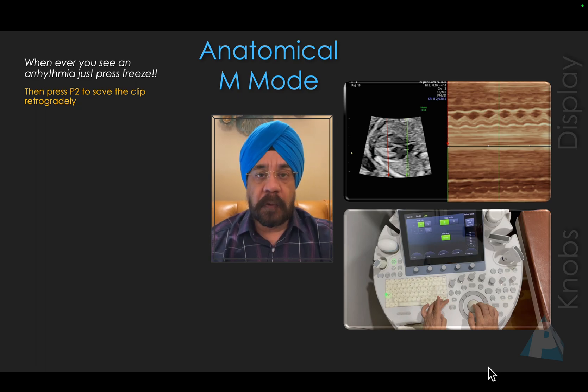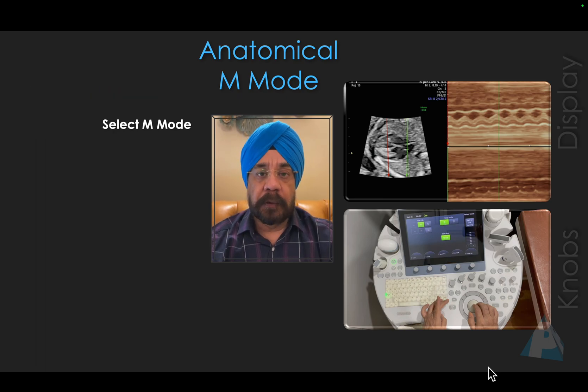Once you've acquired a 2D clip, what do we do next? I'm going to show you first, then give you a demo on the equipment. You just select M-Mode — that is the only option which is actually active once you are playing a 2D clip.